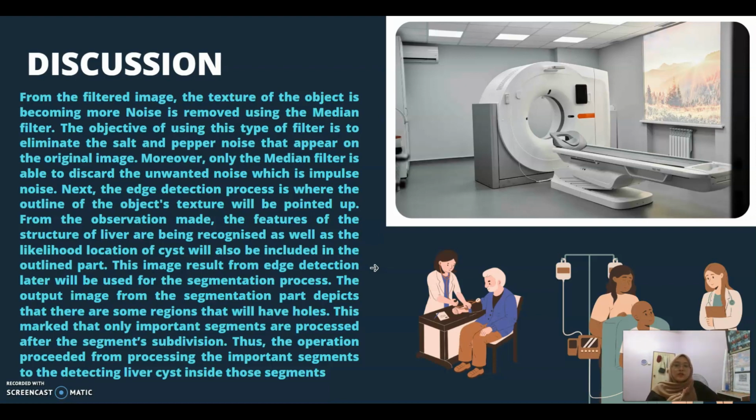The output image from the segmentation part shows that there are some regions that have holes. This marks that only important segments are processed after the segment subdivision. Thus, the operation proceeds from processing the important segments to detecting liver cysts inside those segments.